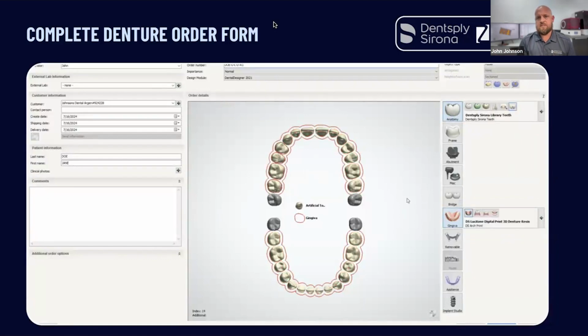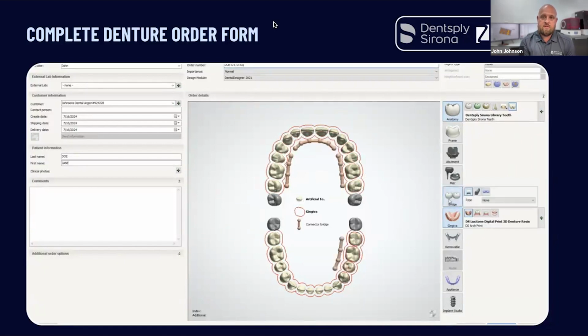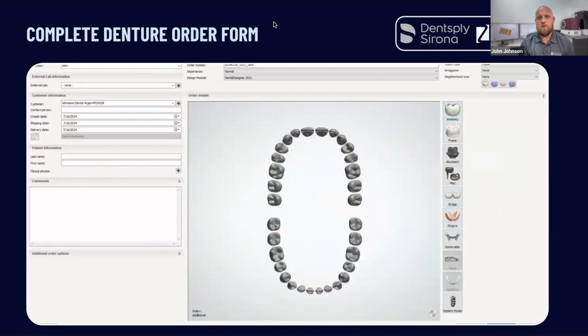But as you can see, I've selected the teeth that I want to produce. Up in that far right, I clicked on the anatomy, and I told it that I wanted to use the Lucitone Digital Print libraries, the Dentsply Sirona libraries. And then I also told it how I wanted to produce my gingiva. That first one has a picture of a denture with sockets. That denture with sockets tells the system that I want to print a separate base along with my denture teeth.